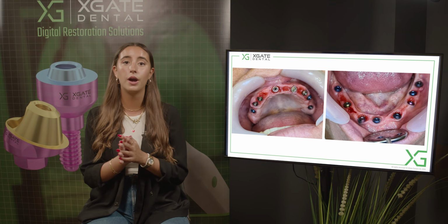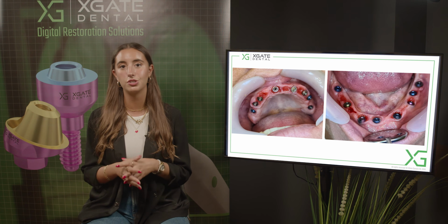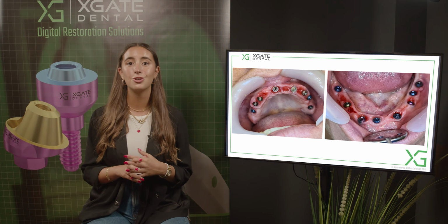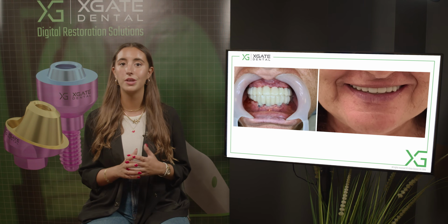the gingiva, that you have indentation for the teeth, and that it will look like the teeth coming out of the gingiva. It's something you want to form in the process of the temporary bridge. It's also something that's quite important. Now, you can see the third temporary bridge that we had.